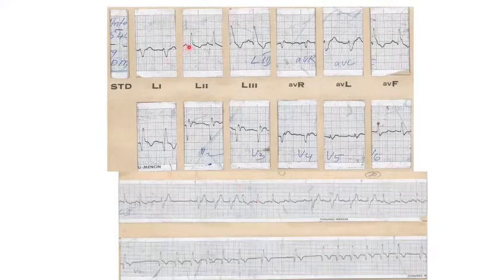You see that? You interpreted this lead here. Yes, sir. Intermittent left anterior hemi block is developed. So you say intermittent left anterior hemi block and intermittent left posterior hemi block. This is a posterior hemi block. This is an anterior hemi block. So there is some more complex AV conduction problem that I am not going into details.